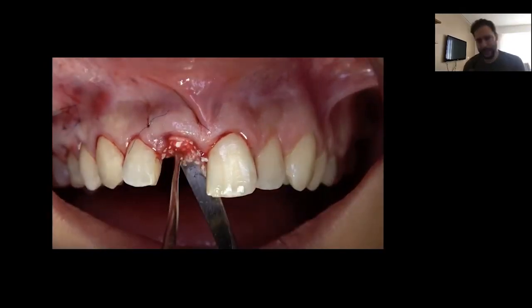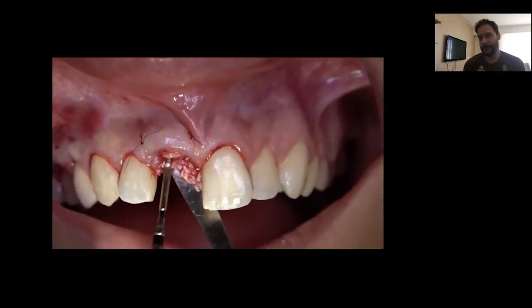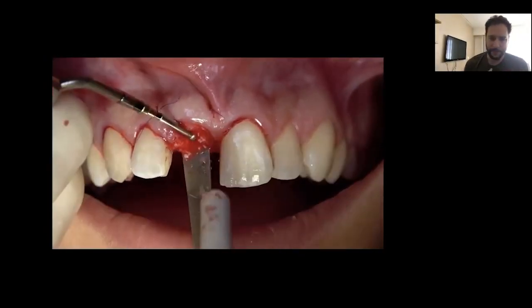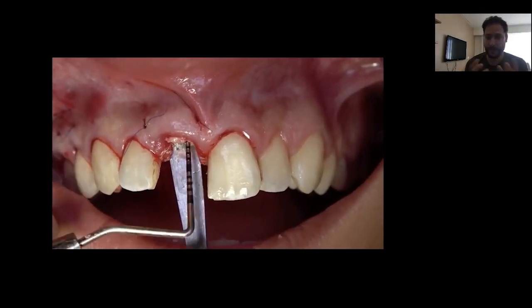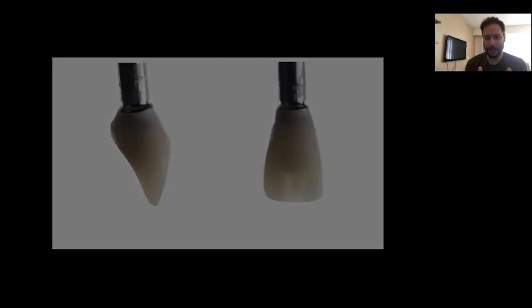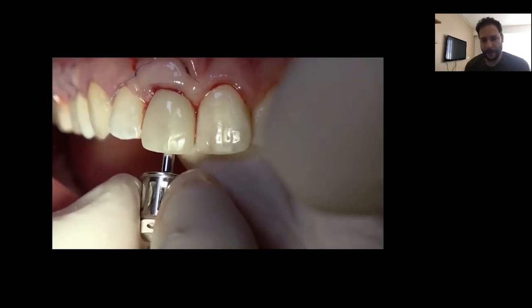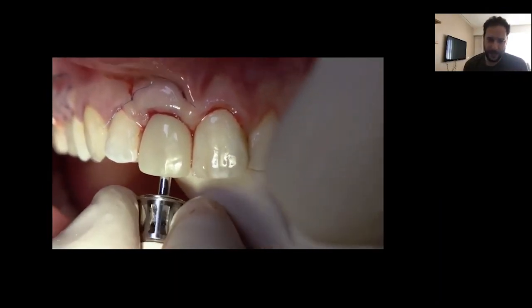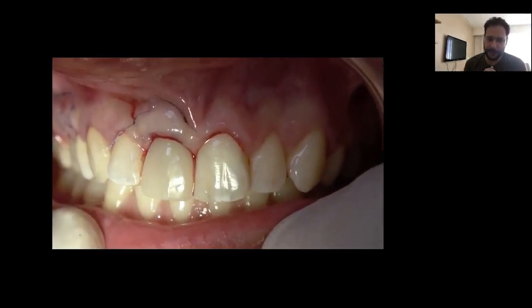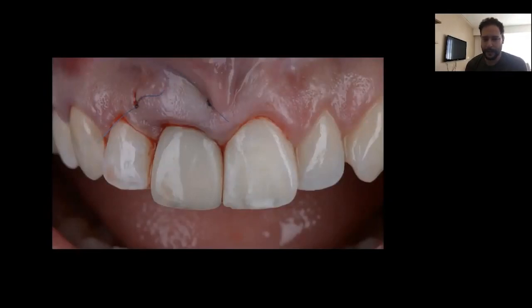After that, we fill the gap between the implant and the buccal wall with xenograft — not to obtain better bone quality, but it will help us preserve the volume intact. With the customized abutment and the provisional already provided by the system, it is very easy to seat the provisional on top of the abutment. At the end, I like to convert it to screw-retained so it can be reversible.